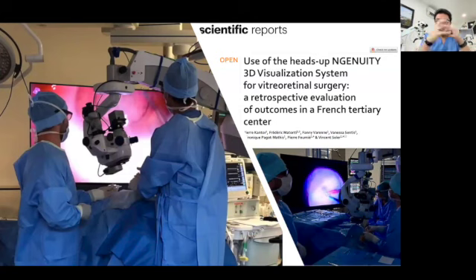Maybe you will need a very big operative room for having one of those. And the screen is not integrated to the microscope, which generates a problem. You can see the surgeons here working in an eye, and the microscope is in front of them, in between them and the screen, and it is generating distractions in the area.